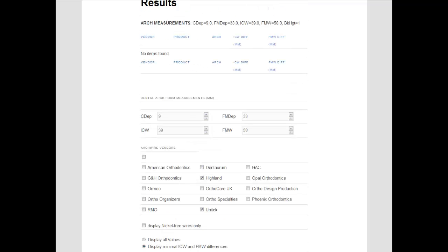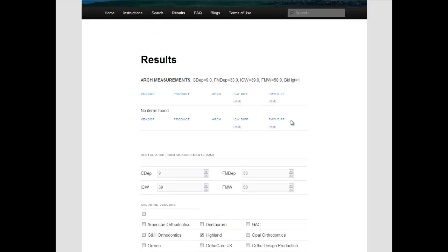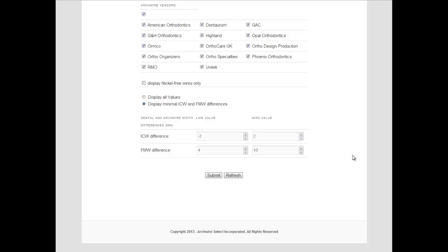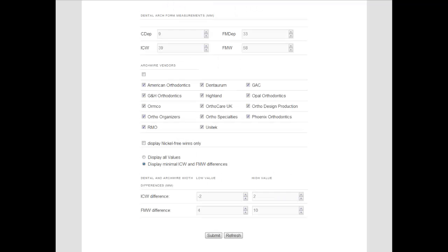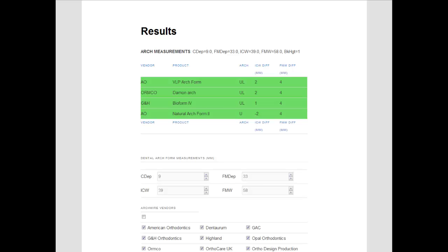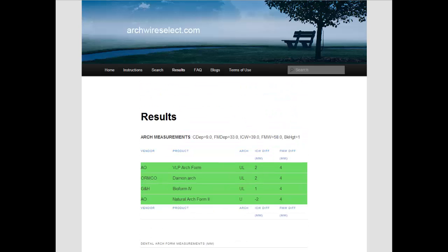The results page shows neither Highland nor Unitek have any arch wires meeting our conditions. Let us try searching the entire catalog. Three vendors have preformed arch wires meeting our treatment goals: American Orthodontics, G&H, and Ormco. We decide on using the American Orthodontic Natural Arch Form 2 Upper because it is the only arch wire with a lower coordinating arch wire. This concludes two clinical examples of using the search capabilities of the ArchWire Select web application.